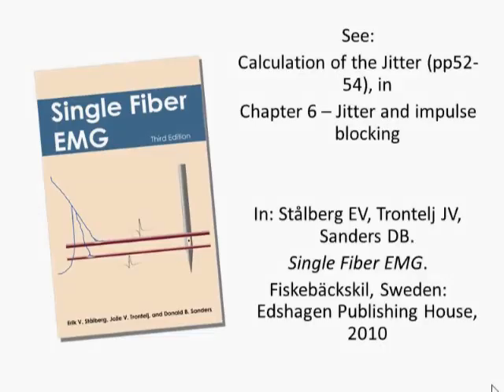Details about the calculation of jitter can be found on pages 52 to 54 in the single fiber EMG book.